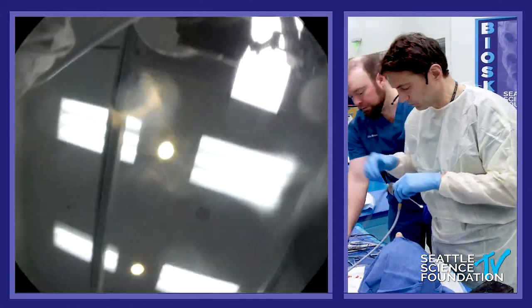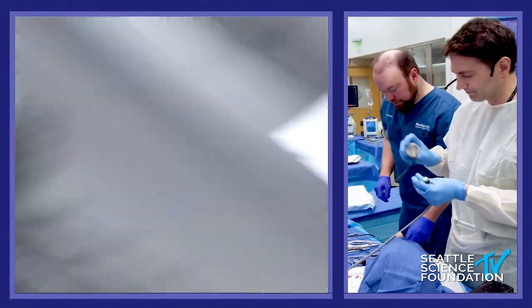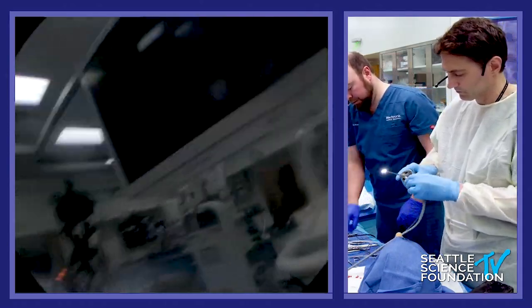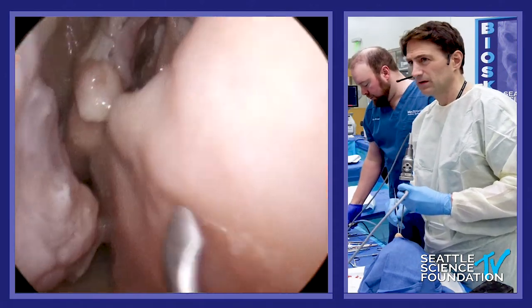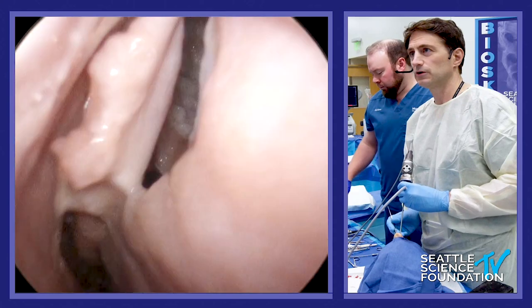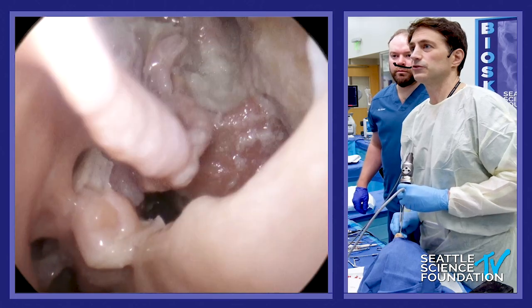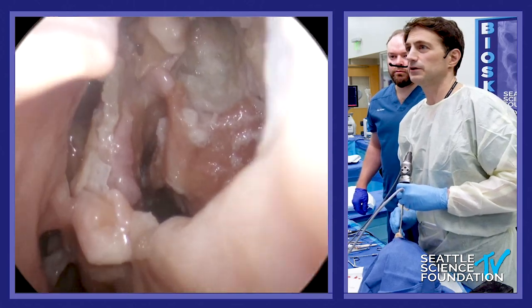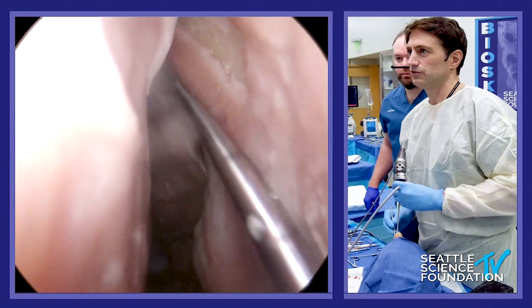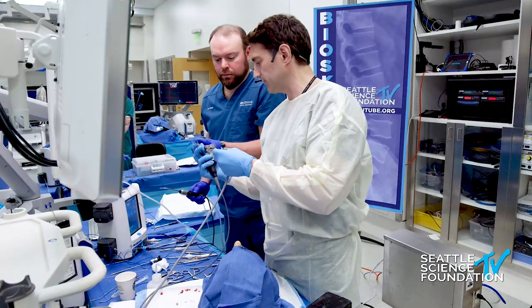So here's our Draf Three. I'm going to show you zero degree — this is how we orient our flaps. Remember, our flaps have been kind of hanging down on the floor, and so we can cover all this bone on the side walls right here. This goes up into the frontal, and I just get it up there and stick it against the blood and secretions. Then I switch back to my 70 and use a frontal curette to swing them up onto the exposed bone.